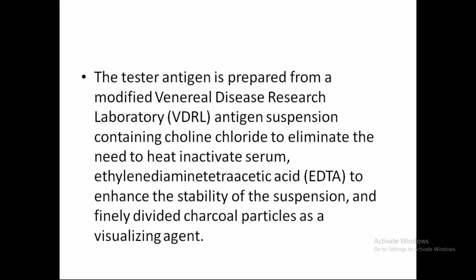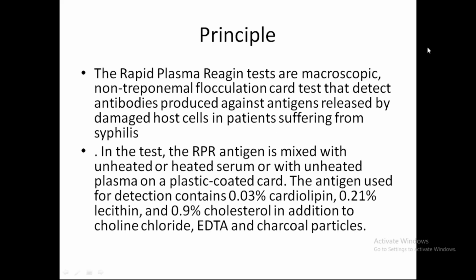RPR tests, rapid plasma reagin tests, are macroscopic, non-treponemal flocculation card tests that detect antibodies produced against antigens released by damaged host cells in patients suffering from syphilis.